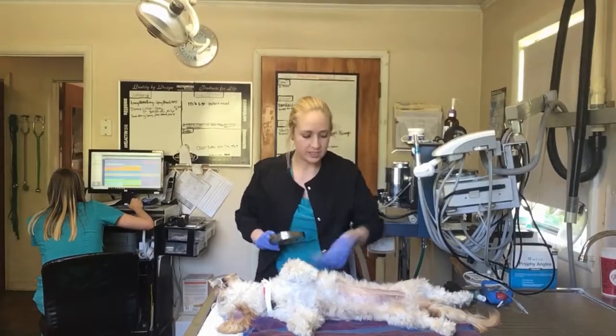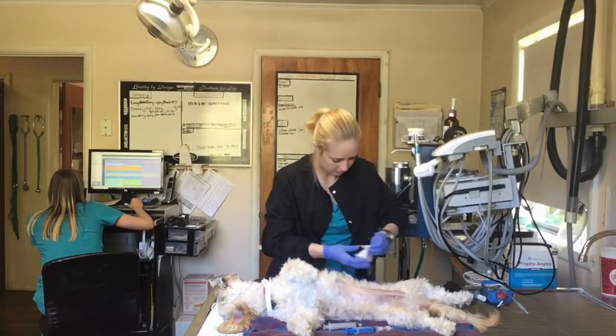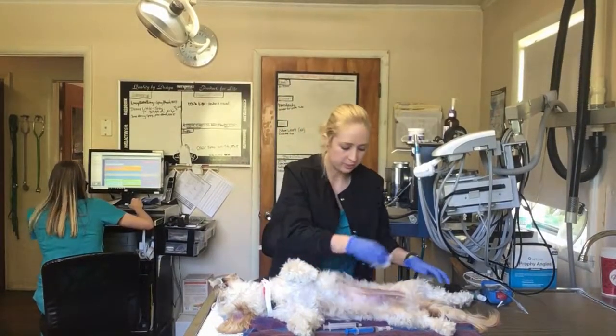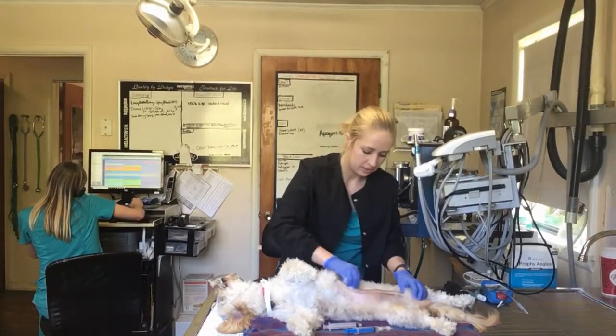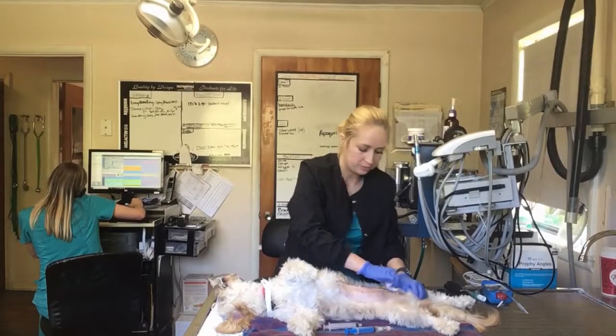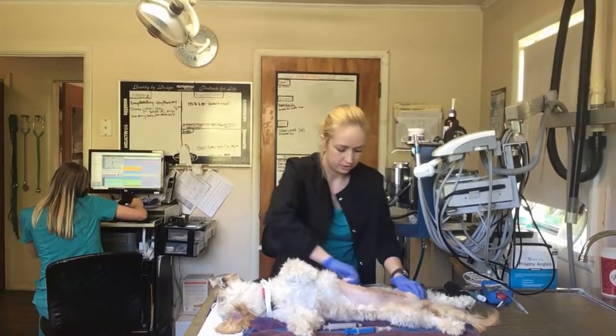So I'm going to scrub three times, first with chlorhexidine and the next with alcohol. You're going to start in the middle and work in a spiral pattern all the way out, not crossing over a place you've already scrubbed before, all the way to the edge of your clip.